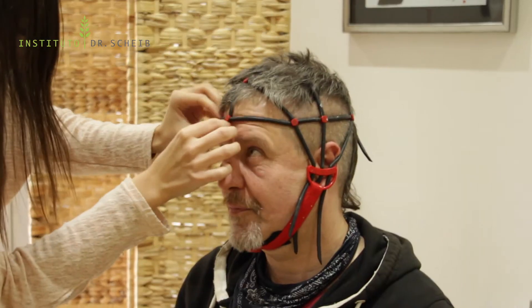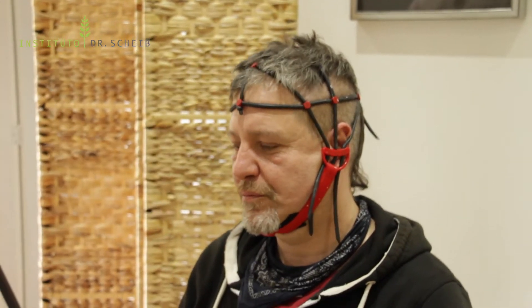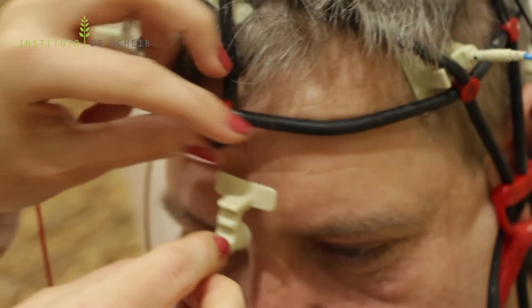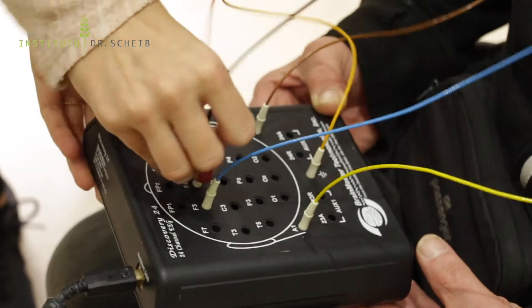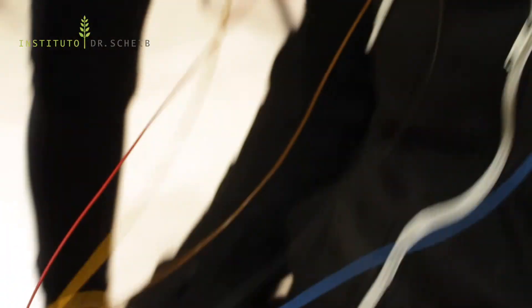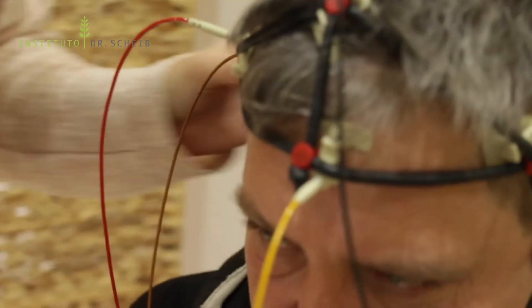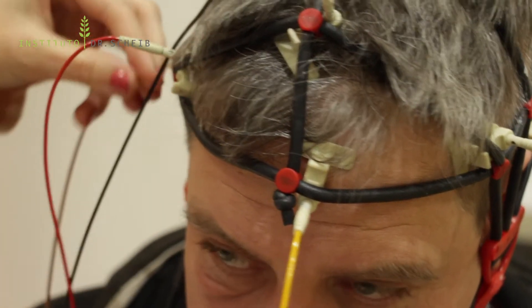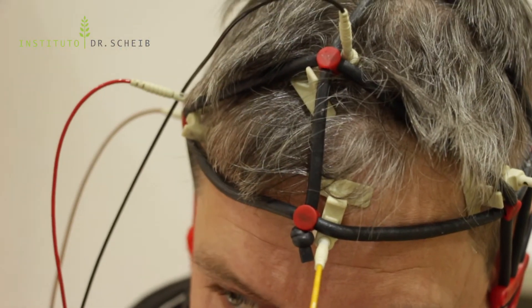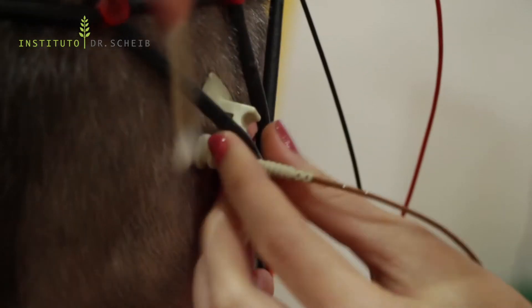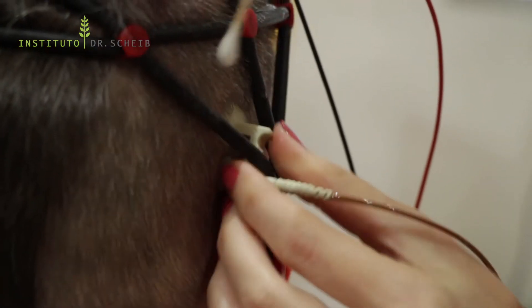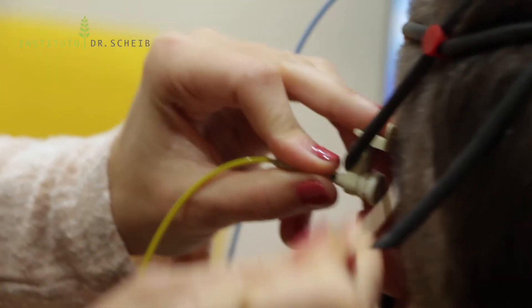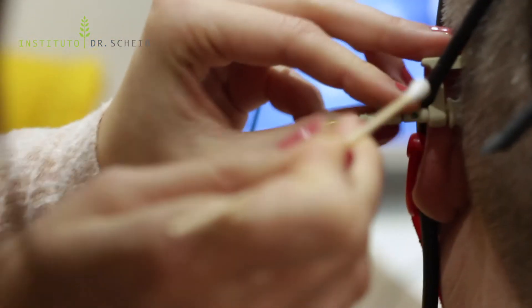The results of the measurement with eyes opened were normal, while the analysis for eyes closed showed a significant increase in the slow frequency range. This is particularly apparent in the increased prominence of the alpha activity in the frontal area.